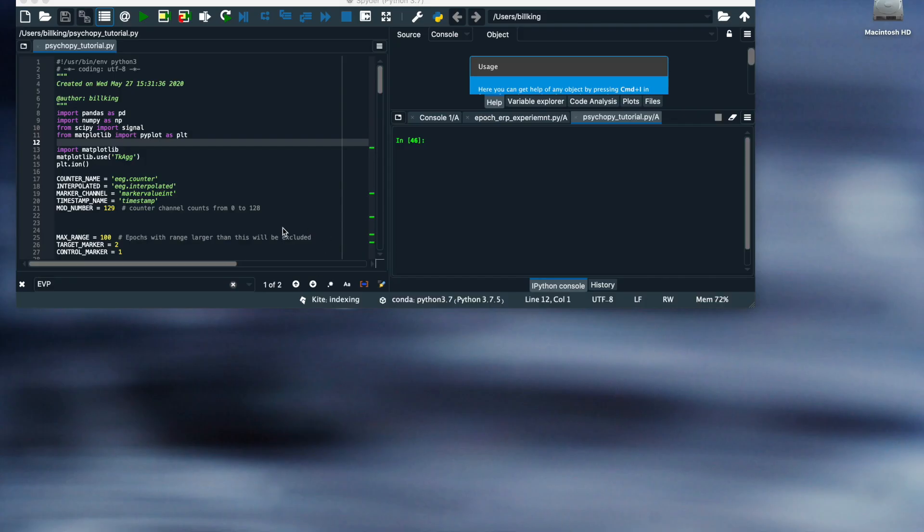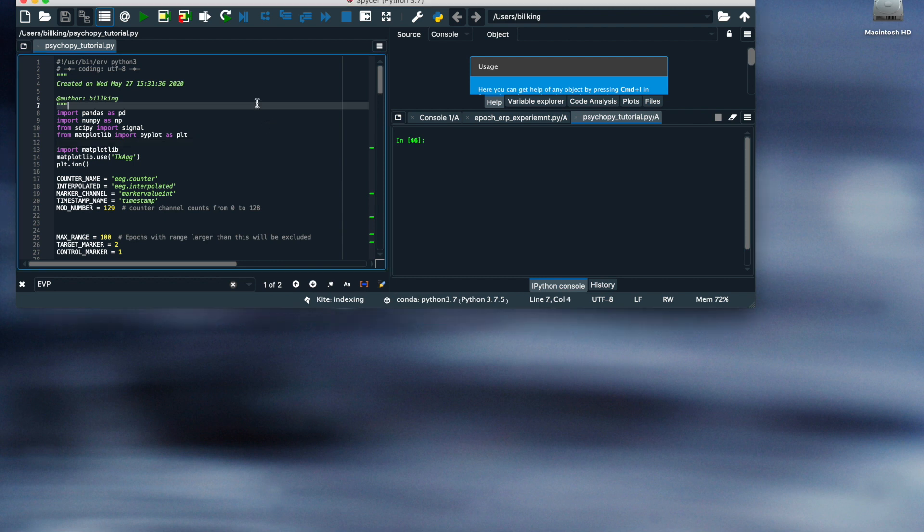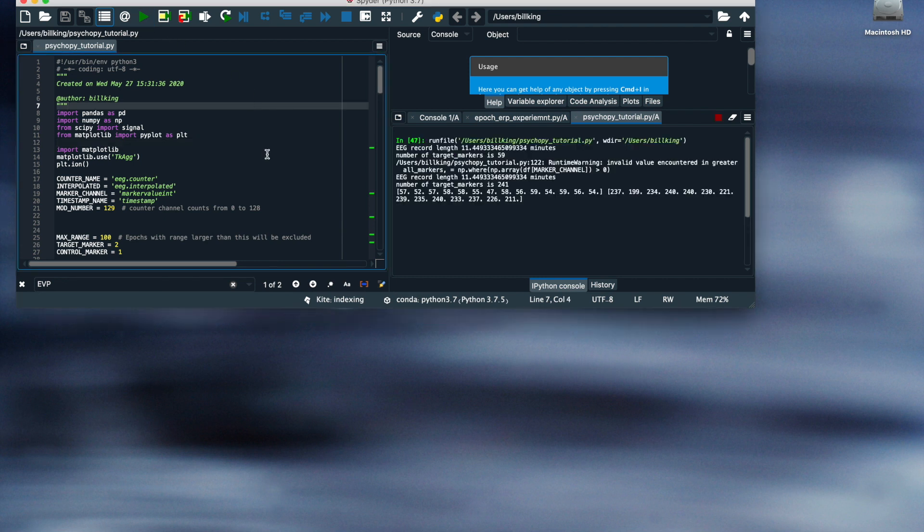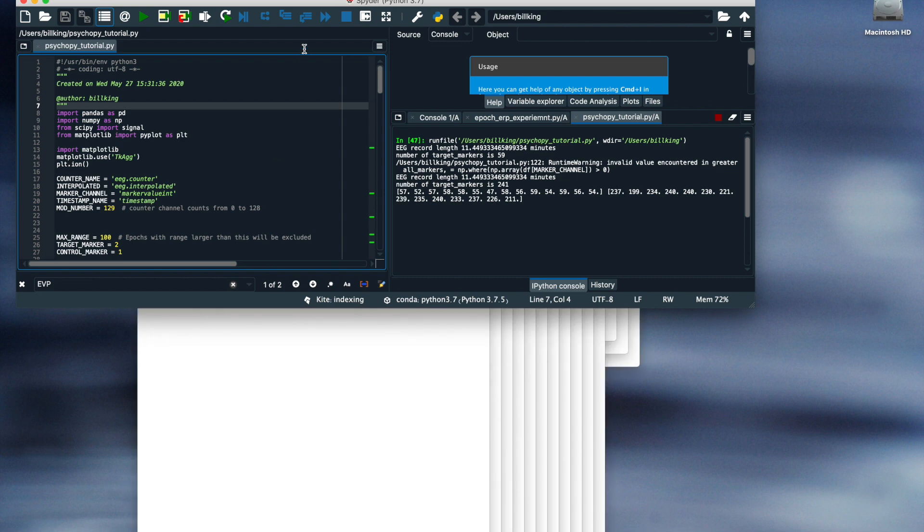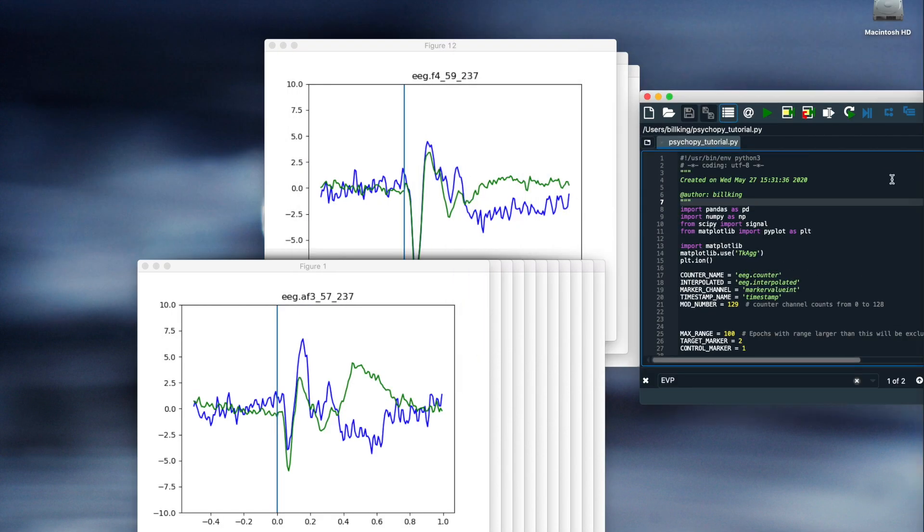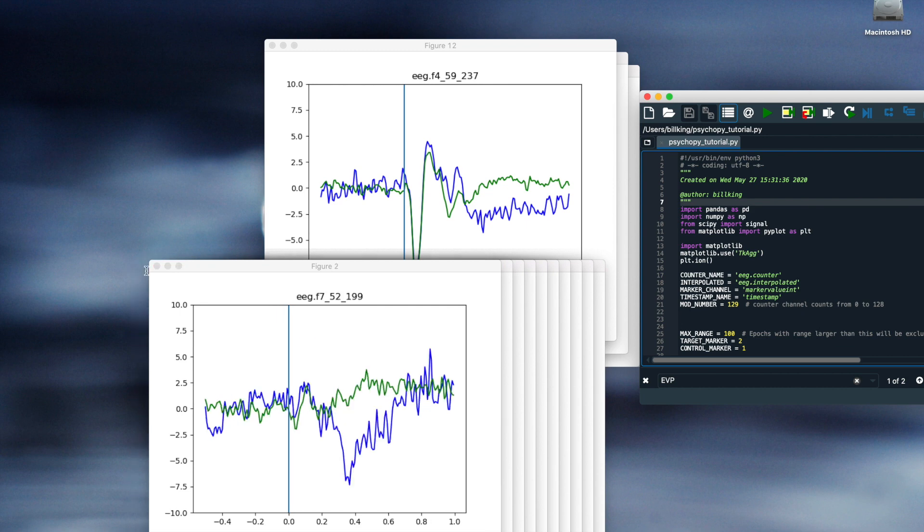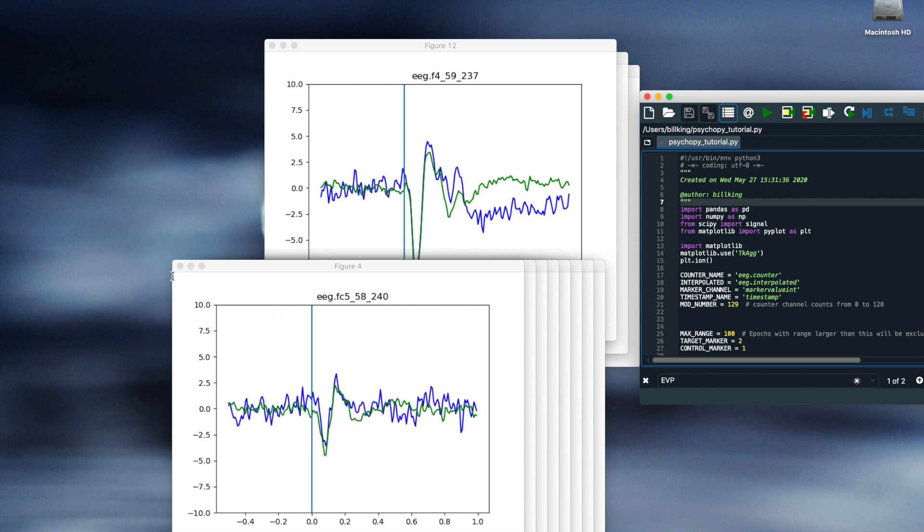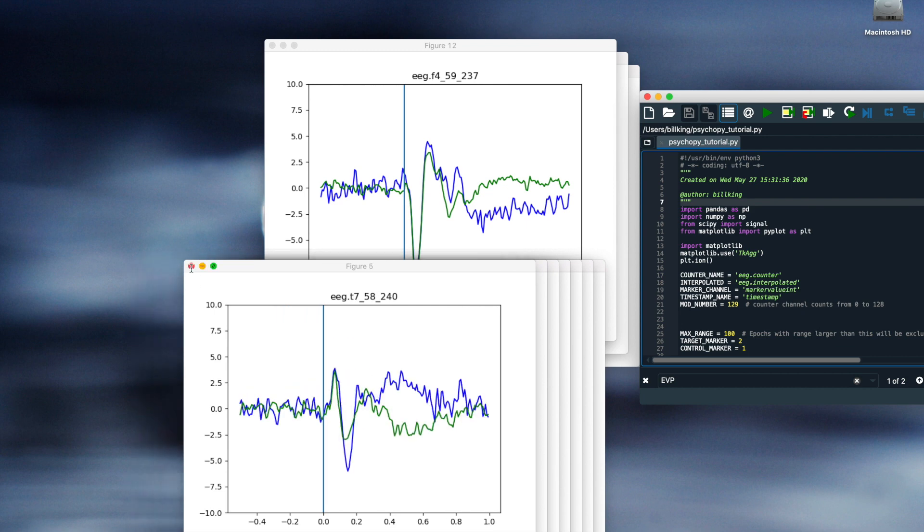To analyze my data, I am going to do a simple high-pass filter, then re-reference the data to the data median and discard epochs if the data range is greater than 100 microvolts. And this is what I get. The blue line is the oddball and the green is the control.